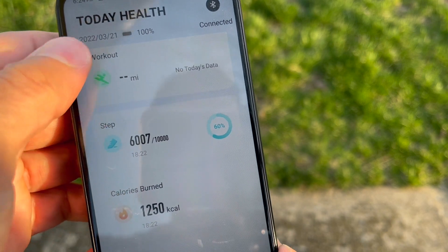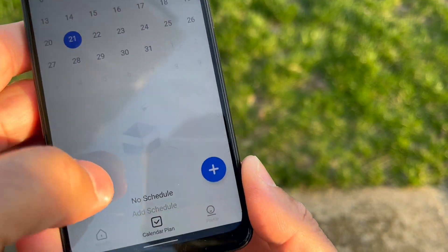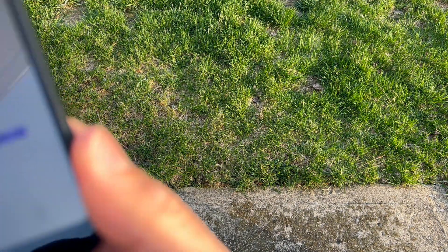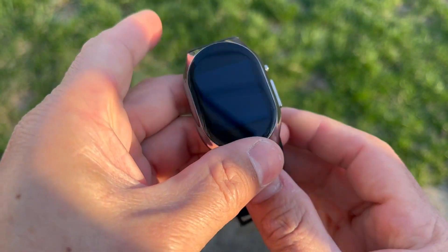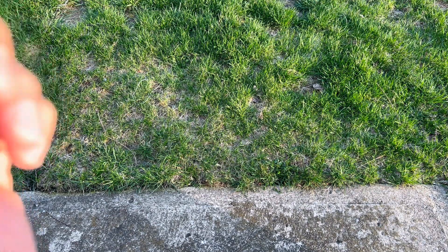The health app for the BP Doctor also has a calendar section where you can schedule alarms, and a profile section with watch information. It's a very comfortable, premium-feeling watch. The one thing to note when taking your blood pressure is you have to have your hand elevated right above your chest — the watch will prompt you if it's not elevated properly.